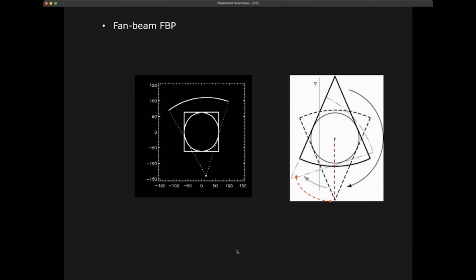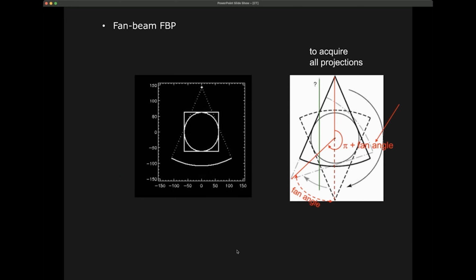Now, this theorem that I've described is for a projection of parallel X-ray beams. But parallel X-ray beams would assume that either we have an X-ray source which is moving over a line for each projection, or we have an X-ray source which is very, very broad, and neither of these is practical.